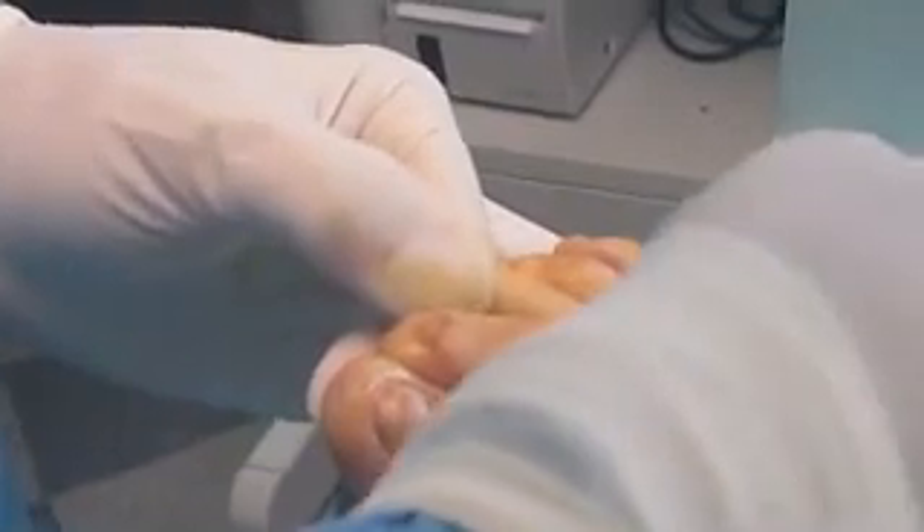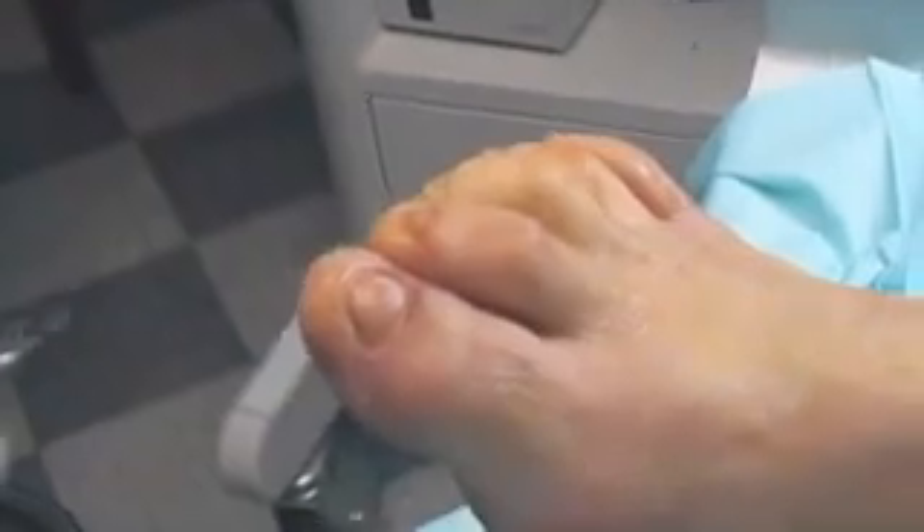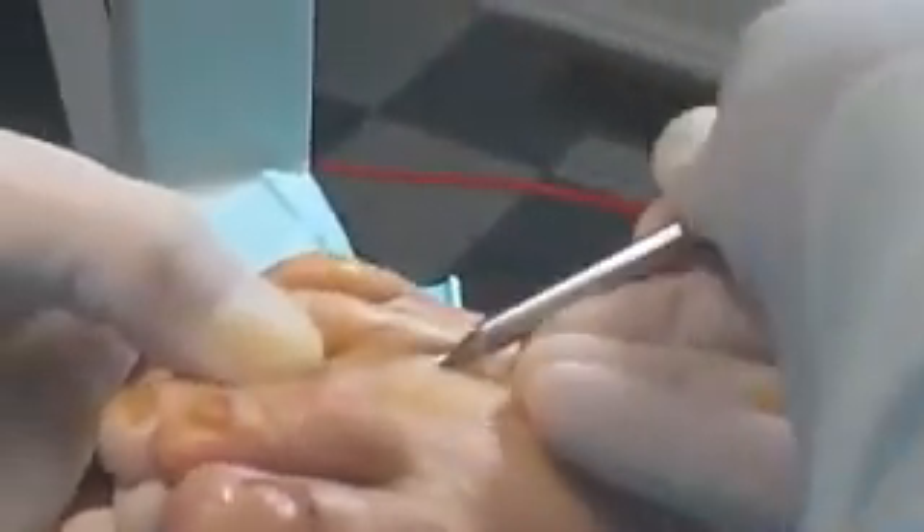Then you can take the blunt side to make sure you're through. Now, to make sure you're done with your surgery — especially when you first start — take a little elevator, go right down directly where you just made your little stab incision. It's so small sometimes you can't hardly get this part in there, but then you come through where you're at, and you can feel if there's any ligament left. And you can see in her case, if you look at the C-arm here, I'm totally free. See how I'm able to sweep this back and forth? So I know I'm totally free of the ligament.